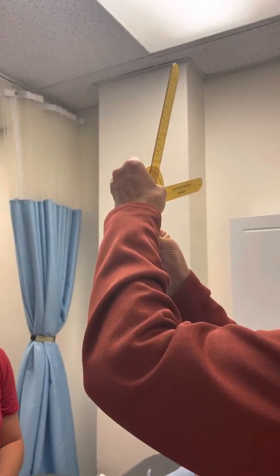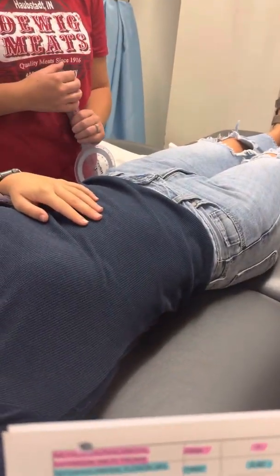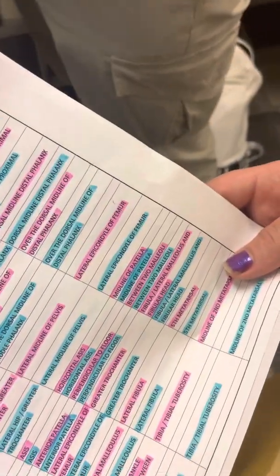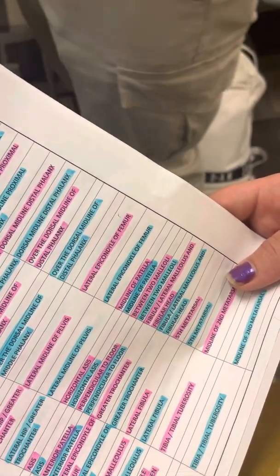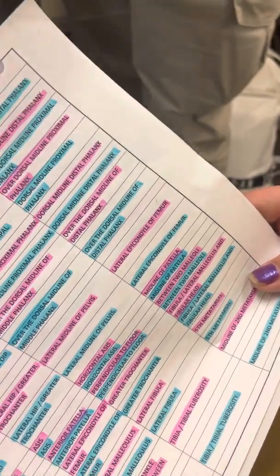Now come back towards the middle. So we went from 90 to about 75, so she's about 15. What's normal, 30? And some of that you'll learn more about in 210, what's called the Q angle, the way the hip comes out. But norms are 0 to 30 for adduction or 0 to 45 for abduction.